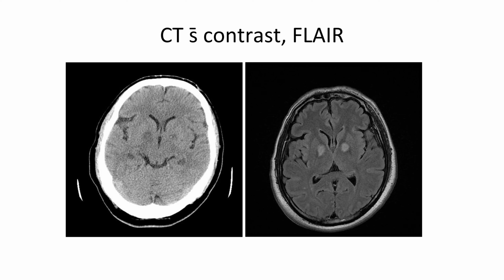So you can barely tell on this CT scan that it's there, only if you're really looking for it. But on the right, on the MRI with a flare, you can see that it's just blaring, it's glowing out at you, that there's something edematous, and this is showing little spots of infarcted tissue.